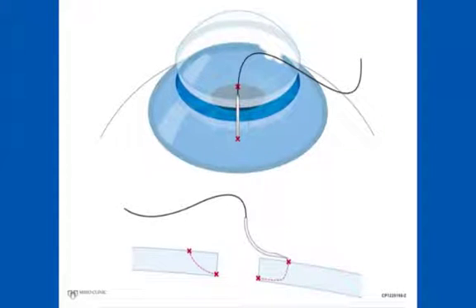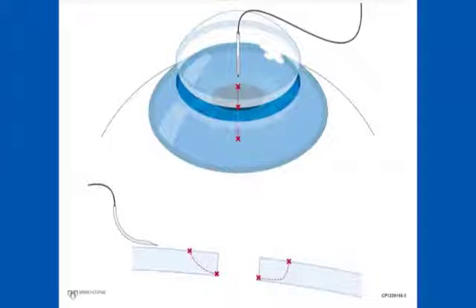Neophytes cannot always tell when they are not parallel to the corneal surface, so we teach them this strategically important position before they move the needle to the graft surface. The next step moves the needle to the graft along the radial line perpendicular to the graft edge and maintains the same needle position parallel to the graft surface.